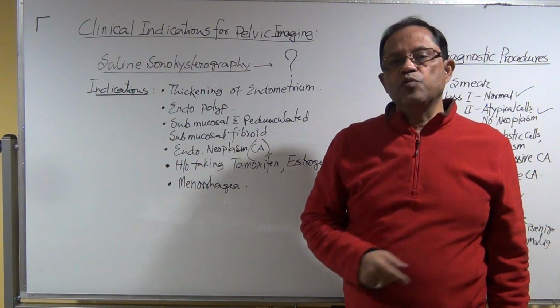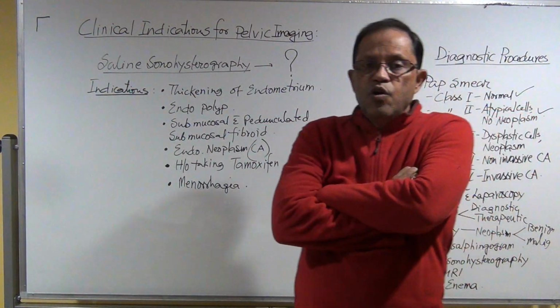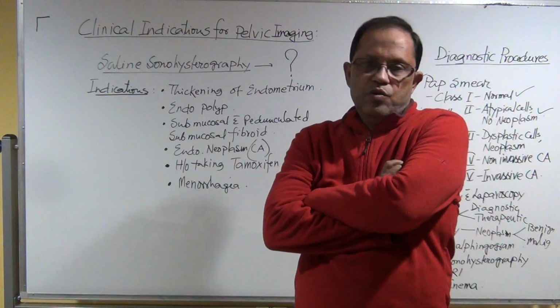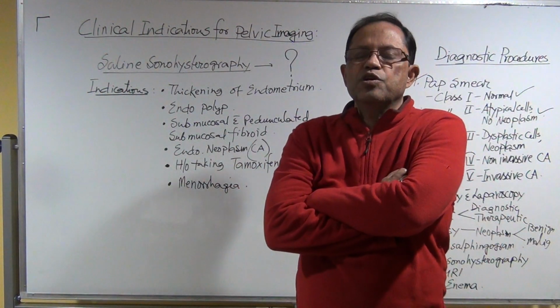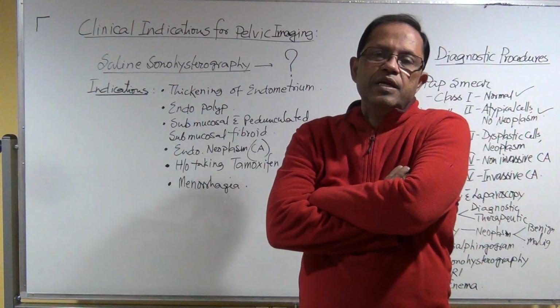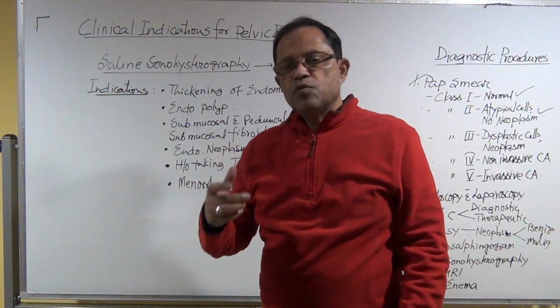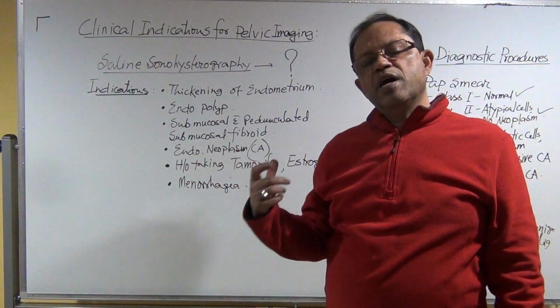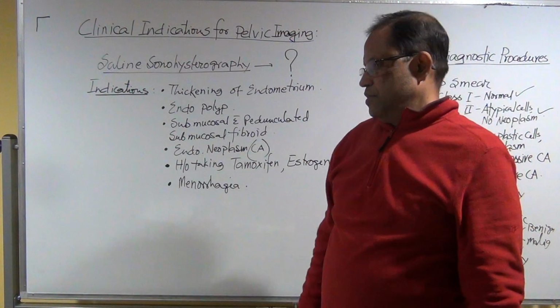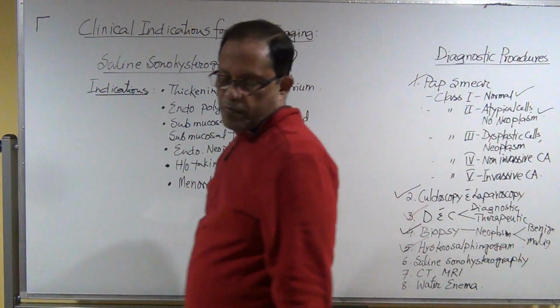And sonographer, your job is to show that water is going into the uterine cavity, and make sure the doctor avoids the air bubbles while inserting the water into the uterine cavity, because air bubbles will give the snow storm or dirty shadow. It might obscure the underlying tissue. Usually the doctor will remove the air bubbles, then they will insert. Okay, and ultrasound can easily identify what is going on.